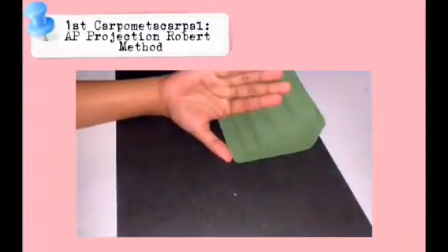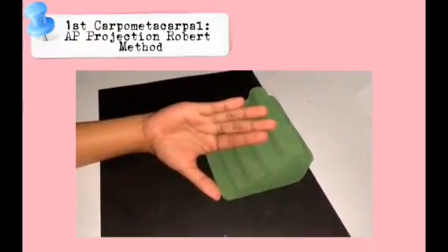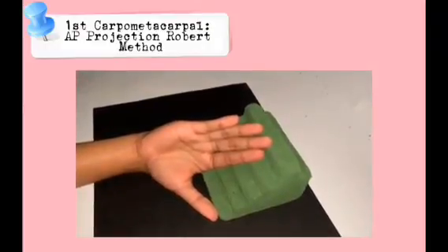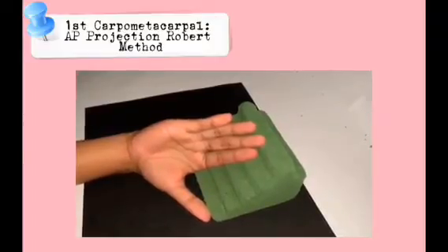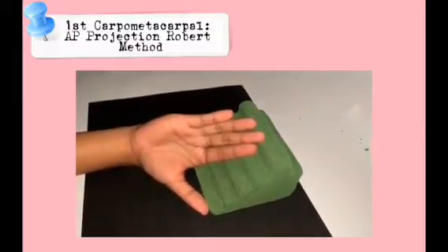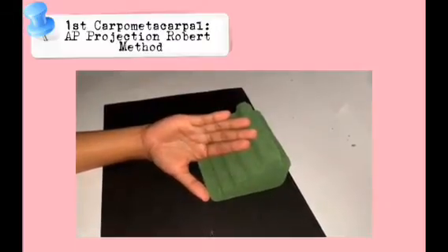First carpometacarpal joint, AP projection, Robert method. Position of the patient. Seat the patient sideways at the end of the radiographic table. The patient should be positioned low enough to place the shoulder, elbow, and the wrist on the same plane. The entire limb must be on the same plane to prevent elevation of the carpal bones and closing of the first carpometacarpal joint.